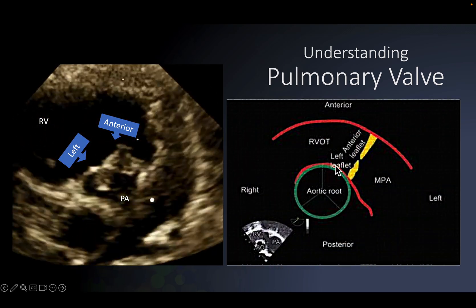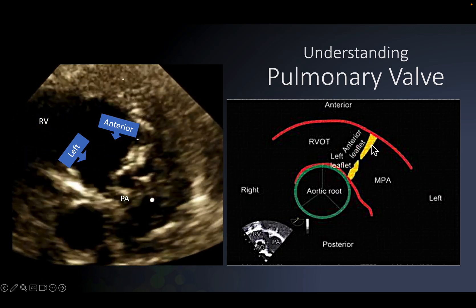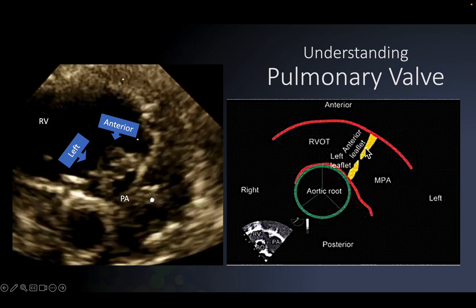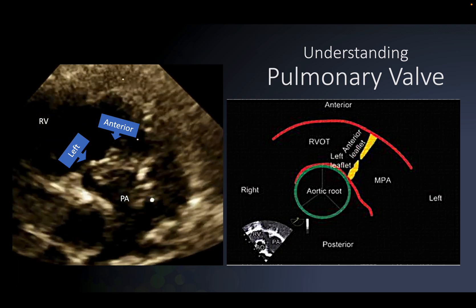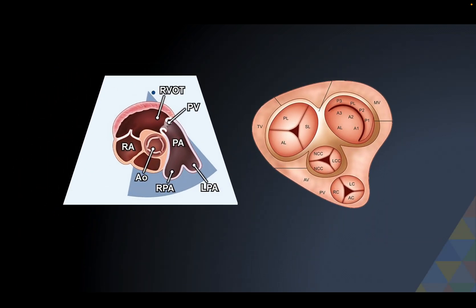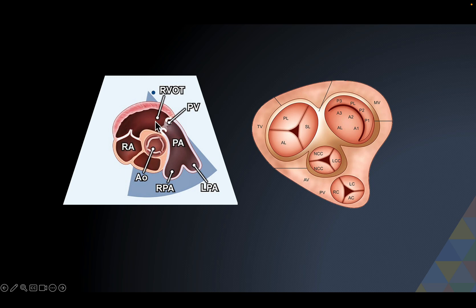In the cross-section view, you have the aorta and RVOT with an anterior leaflet and a left leaflet. I'm discussing the anterior and left leaflets because we can actually see all of them - don't be surprised. In the parasternal short axis view at the level of the aortic valve SAX, you can see the right atrium, interatrial septum, right ventricular outflow tract, pulmonary valve, and pulmonary artery - here is the anterior pulmonary leaflet and the left pulmonary leaflet.